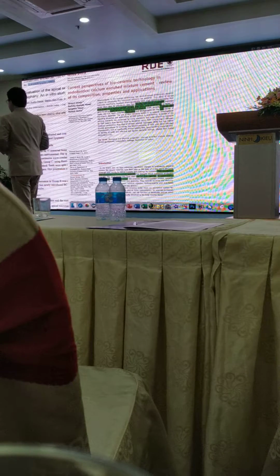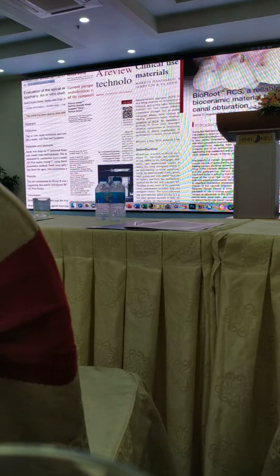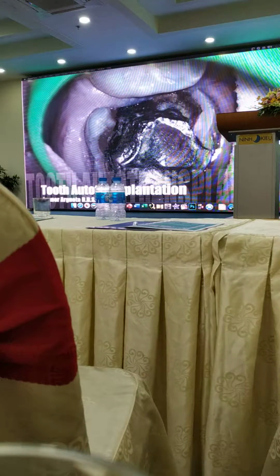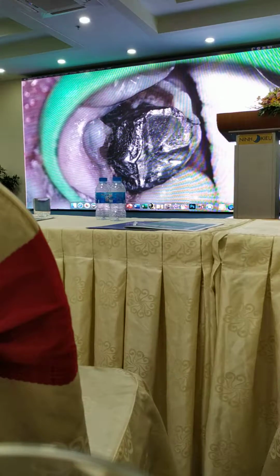And there is a lot of scientific information related to bioceramics. You can find a lot of articles related to this kind of technique. Look at this case. I will let you see the video for a general idea of what I did in the case.